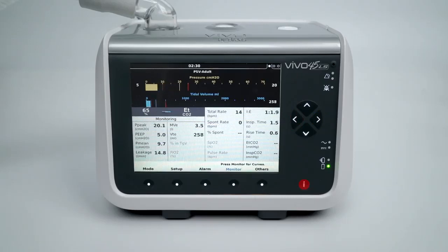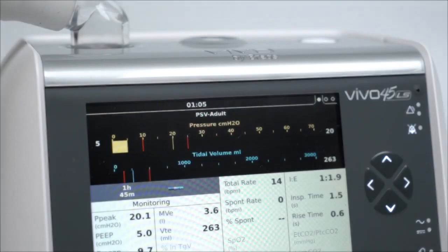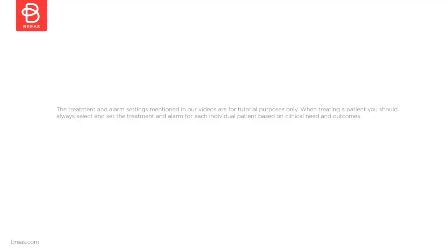Finally, below the navigation buttons is the I button. This is used to provide context-sensitive help to highlighted menu selections. This concludes this video about the front panel and pre-use test tutorial for the Breas Vivo 45LS.